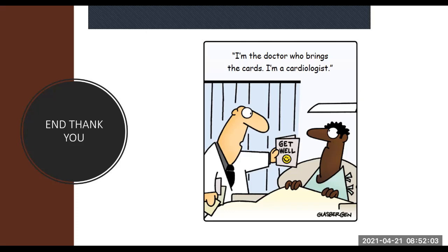We had that atrial fib patient the other day, and it was such a lovely thing. You could actually see the fibrillations, you could see the thrombi. You guys were there, you saw it. So it was a nice thing. It kind of confirmed to us what we were seeing. All right, and it confirmed this is really what we found on this patient. So that's the way that you've got to look at it first. Don't rush to put an echo on. First do everything else, and then come back to do it.